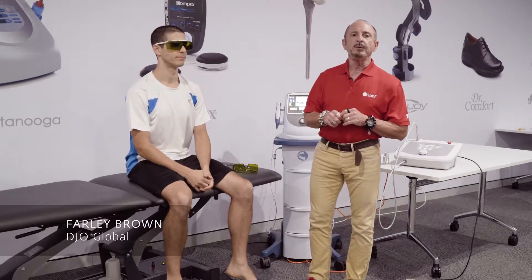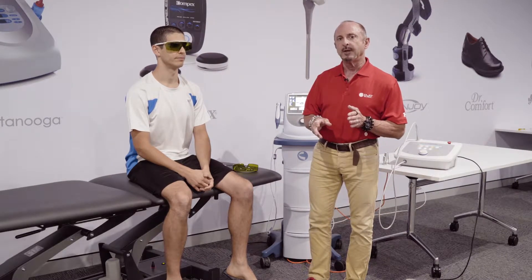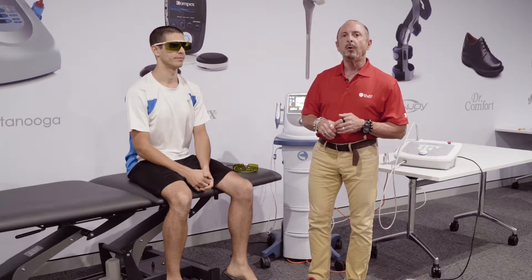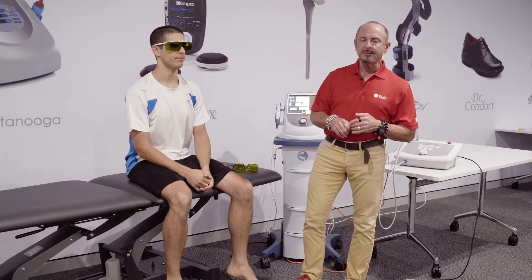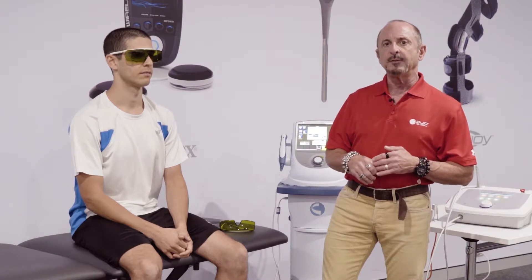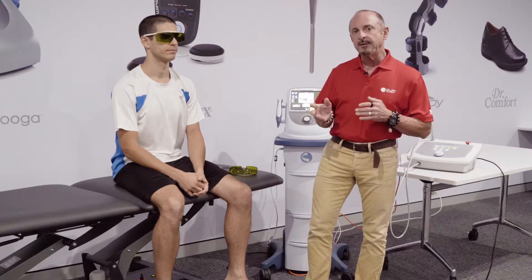Today we're going to look at low-level laser and high-power laser. Traditionally, over 500 milliwatts is our high-power Class 4 laser, and under 500 milliwatts is our Class 3B low-level laser.